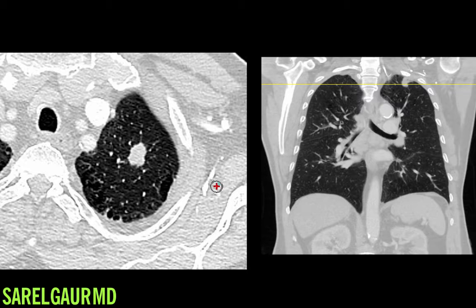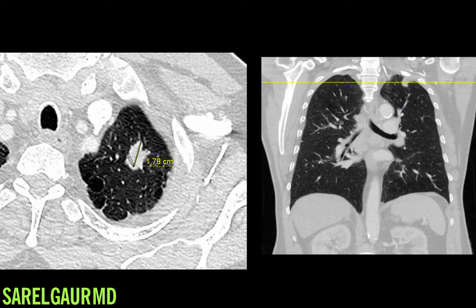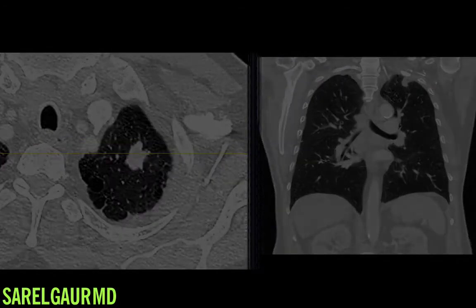The patient doesn't have any prior CTs. I'm going to go ahead and measure the nodule. This nodule measures two centimeters. I know that this nodule could be further characterized by PET CT if indicated. I'm also going to look in the patient's history for any risk factors for lung cancer. It happened to be that this patient had 40 pack-years of smoking. So in my mind, there's a high probability that this nodule represents cancer.